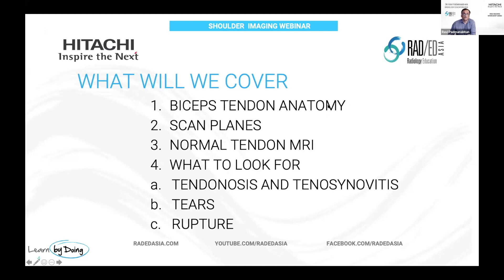We're going to start with the tendon anatomy — the proximal anatomy — and also look at the scan planes we're going to use to assess them, because the biceps tendon is not a straight structure; it curves around, so we need to know which scan planes to use. Then we'll look at the normal appearance of the tendon and all the abnormalities.